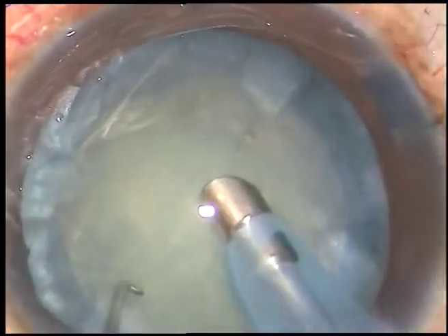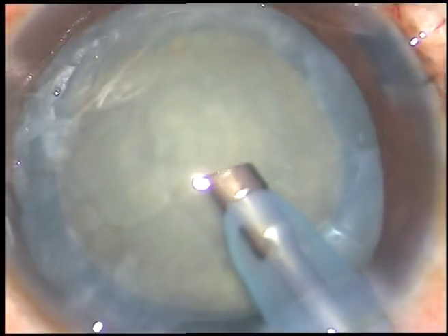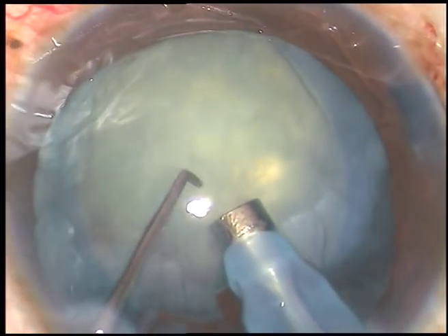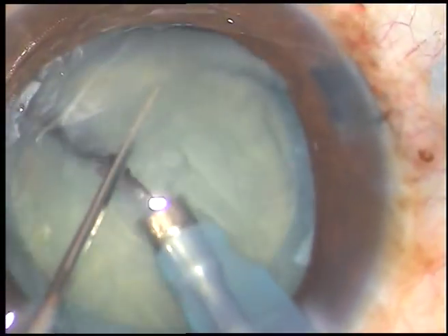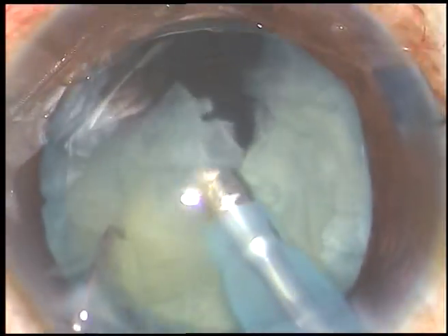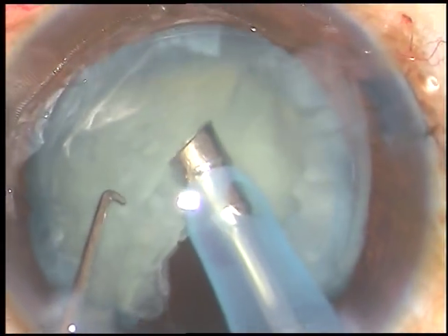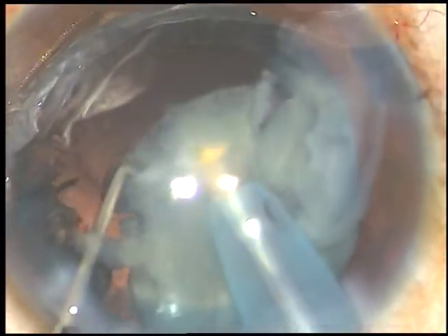In intumescent cataracts, the hardness of the nucleus varies from very soft to very hard. In this case, I'm going to do a direct chop. The nucleus is pushed a little downward, I engage the tip and chop it. The nucleus is rotated, held at another place and chopped. This free nuclear fragment is emulsified and removed. I rotate the nucleus again, chop at another place, and this nuclear fragment is emulsified and removed.